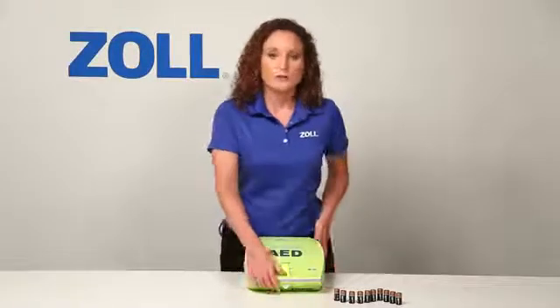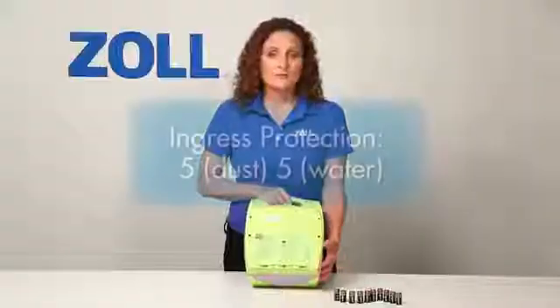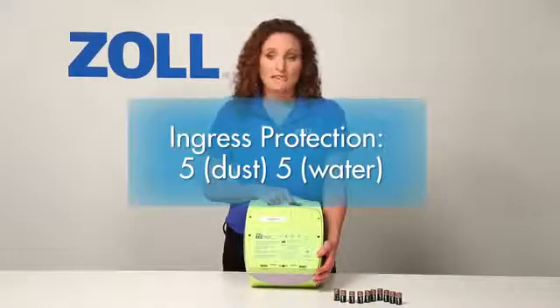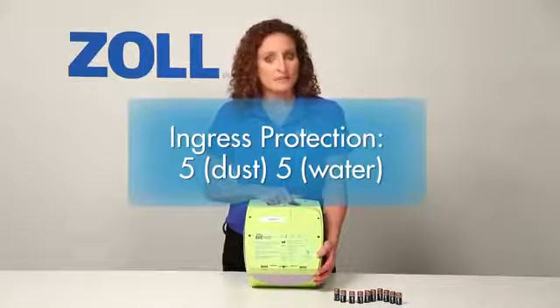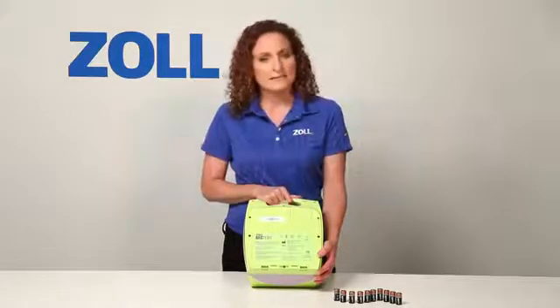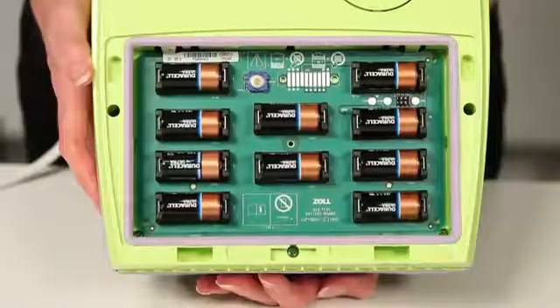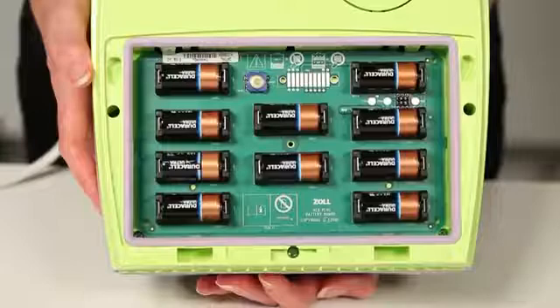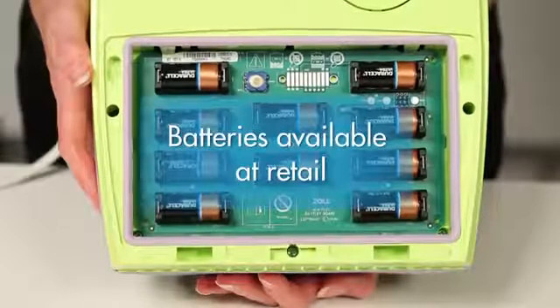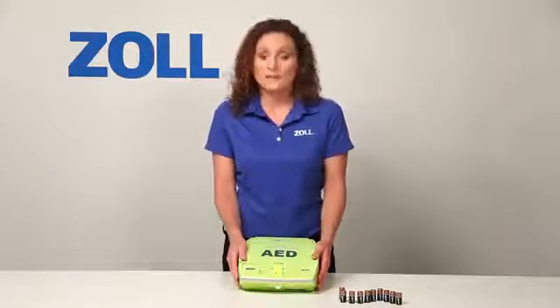Let me review a few other features of the AED Plus. Notice that the door to the battery compartment has IP55 printed on it. The ingress protection rating is 5 for particles, meaning it's protected from dust, and 5 for water, meaning it can withstand spraying jets of water. Very few AEDs in the market today are this well protected against dust and water. The AED Plus is powered by 10 123A lithium batteries, which you can purchase at retail — for example, from any camera store — relatively inexpensive compared to proprietary battery packs that other manufacturers sell.